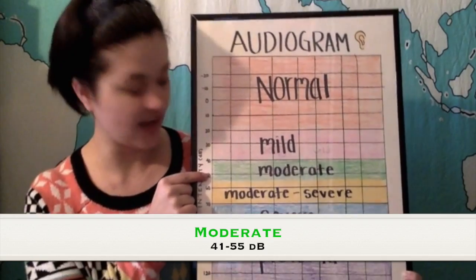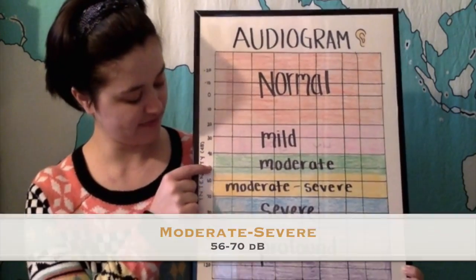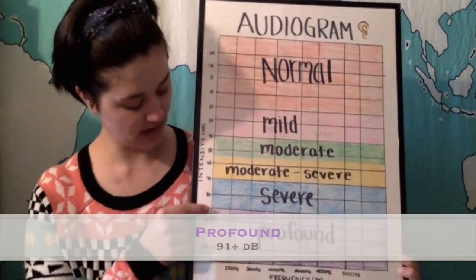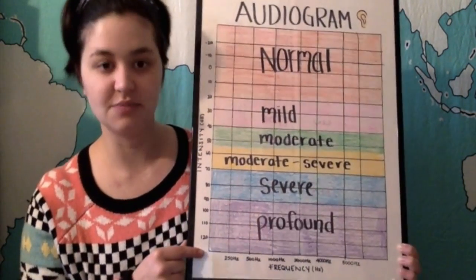From 40 to 55, a moderate hearing loss. From 55 to 70, moderate to severe. 70 to 90, severe. And 90 and above is profound.